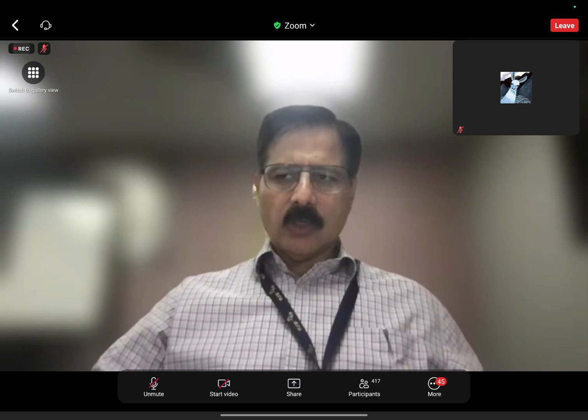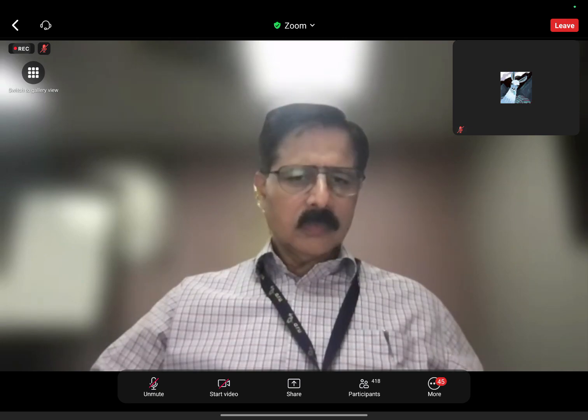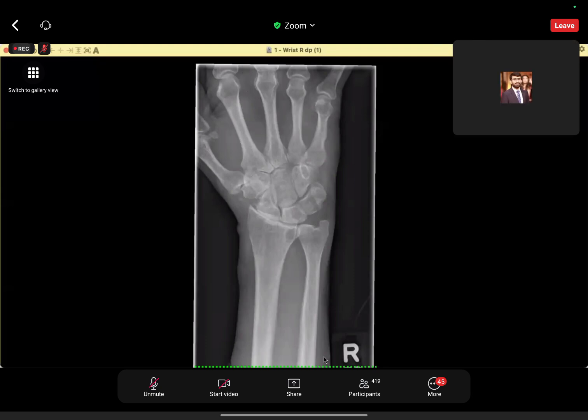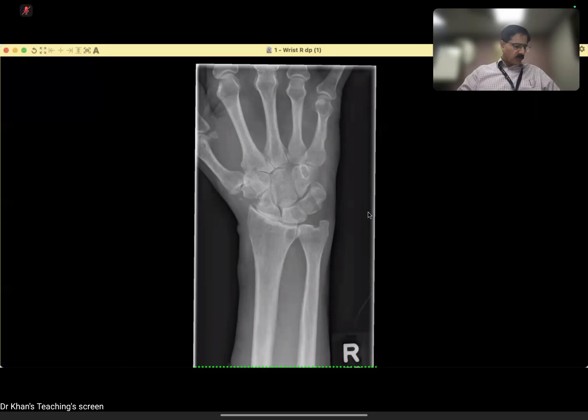Now, can you hear me? Okay, so this case is a 67-year-old male with right wrist pain. Over to you.